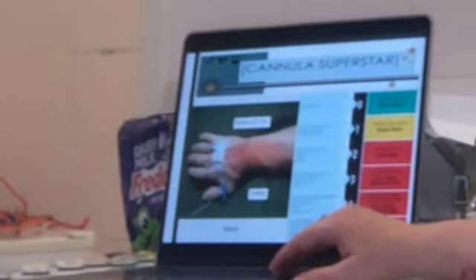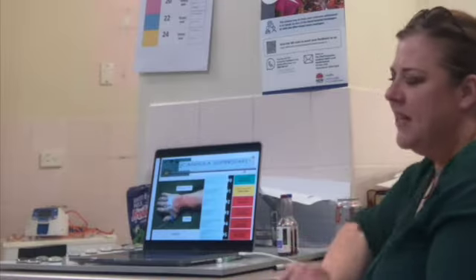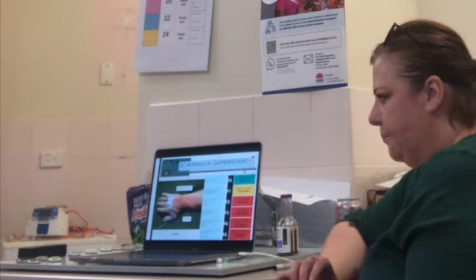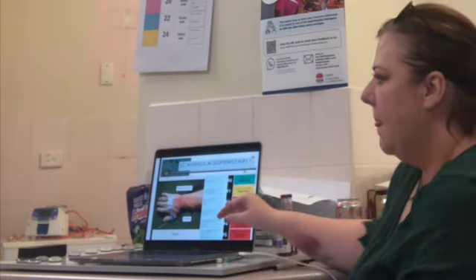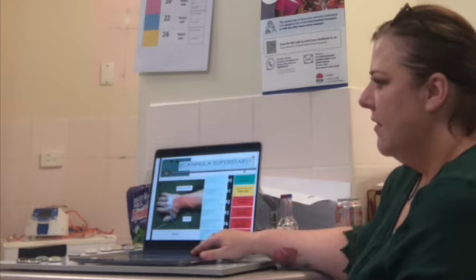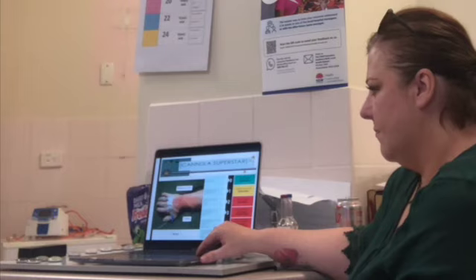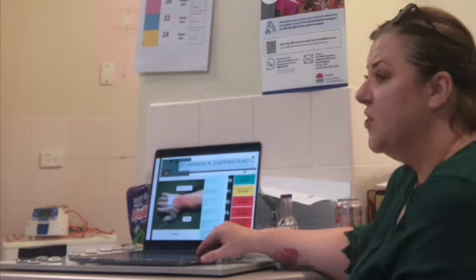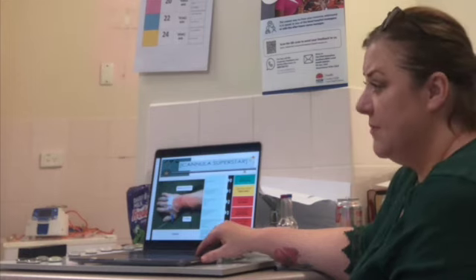Did you say there was pain? What do you think? No, because it's a dummy, it can't. So do you think the VIP is 2? Anyone think any different? Anyone want to argue? Well, we can't assess pain if they're not feeling, can't talk to them. So it's a dummy, so he doesn't get a pain score. That's what I went with.